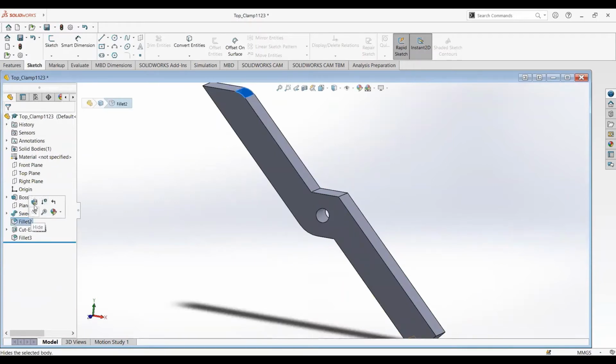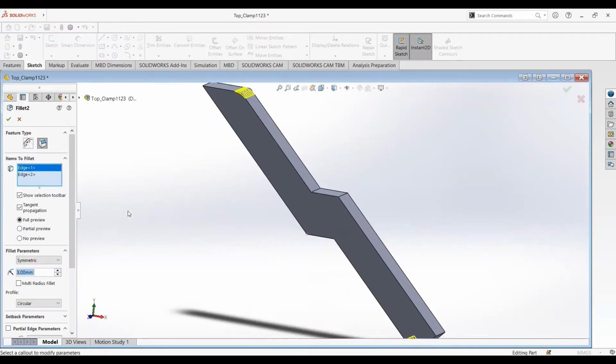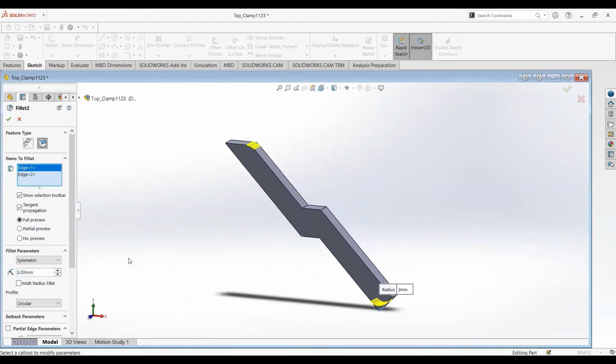And then we used fillet. I'm gonna zoom out a little bit. Okay, we use fillet on this edge and this edge because we need to make this more curvy, no sharp edges, especially for this part because we want the top clamp to move smoothly in our device.